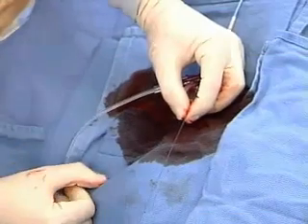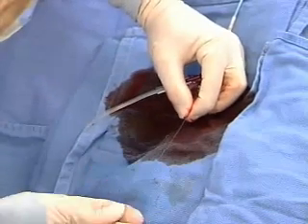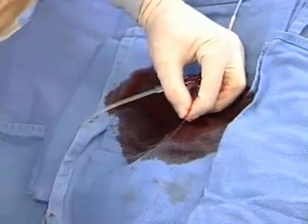When you see that appearance of the stent bulging a little bit bigger than the vessel itself, that's a sign of a very good implantation. It means that the metal is driven well up into the wall of the blood vessel. The risk of the stent clotting or reblocking at this point is extremely low. That's an excellent result. So we have now removed the balloon. We're going to put the intravascular ultrasound back down the vessel.